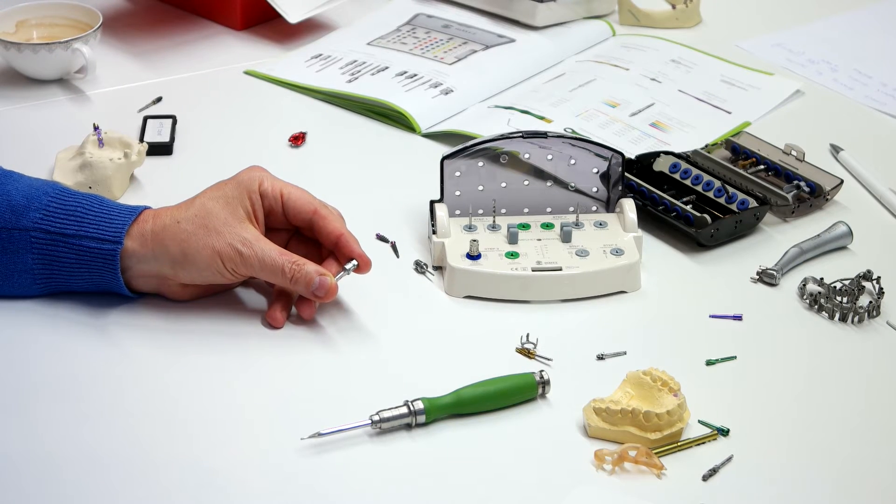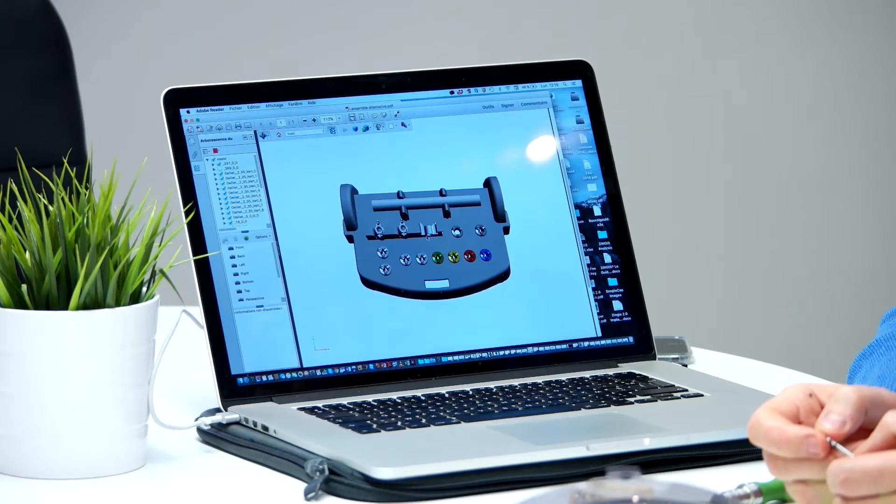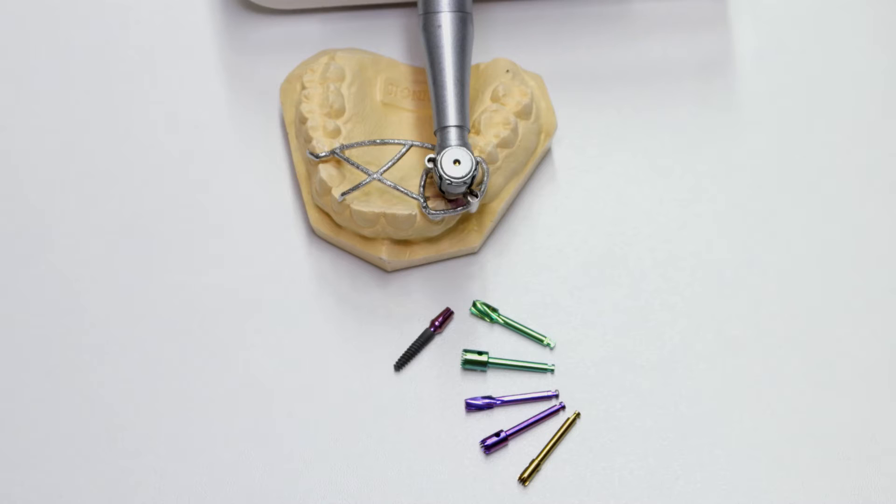I'm coming here to develop together with Trit the instruments to fit into the Twingis — the new Twingis guide 2.0 — to be able to place the implants correctly. This means getting the angles and depth right, and being able to place the temporary prosthetics and then the final prosthetics in the right way.